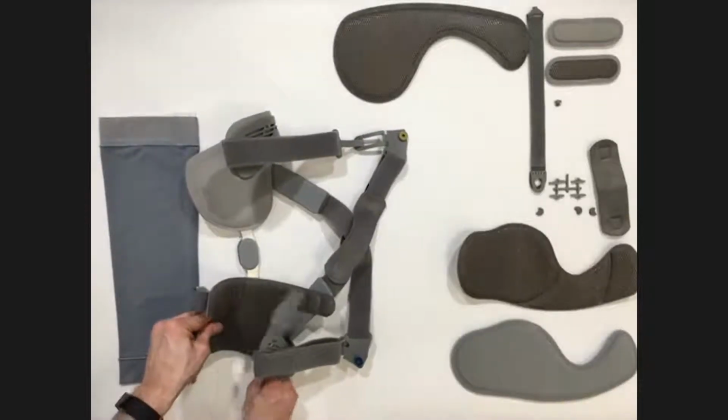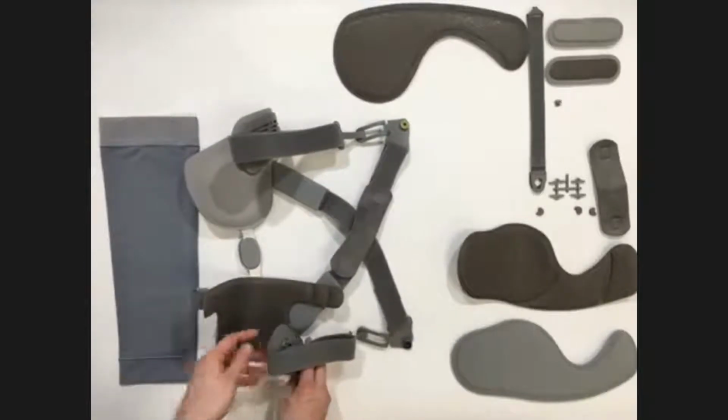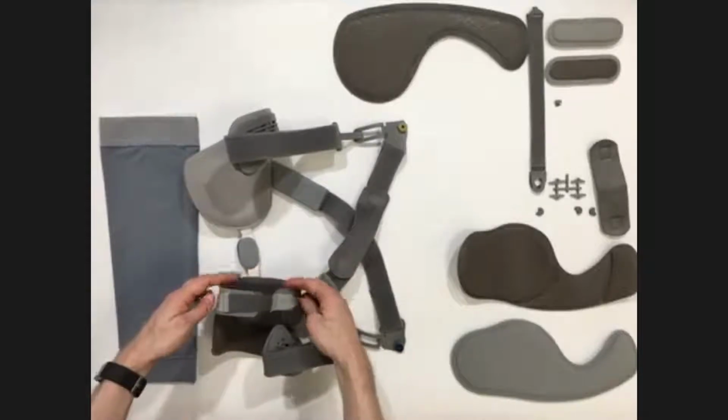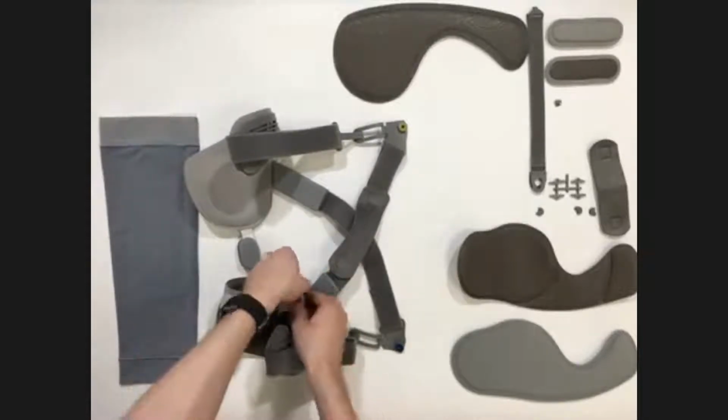So that wraps round and then fastens over the top of the gastroc. So I'm placing that back round into position exactly as I would have before, and you can see that this fastens around and holds it into position. So I'm quickly going to fit that to Pete.